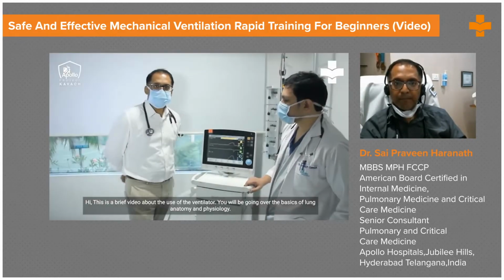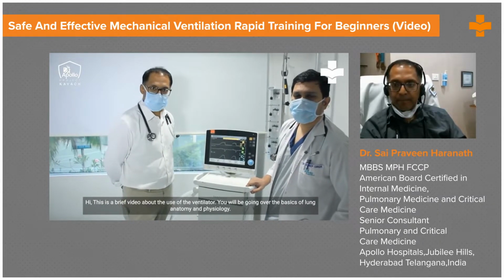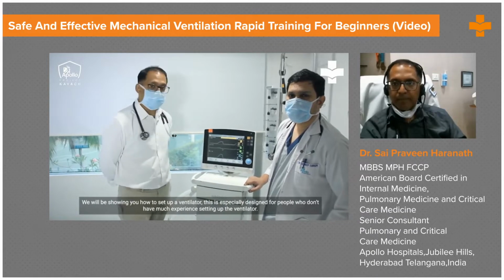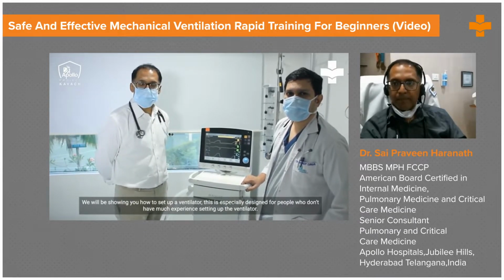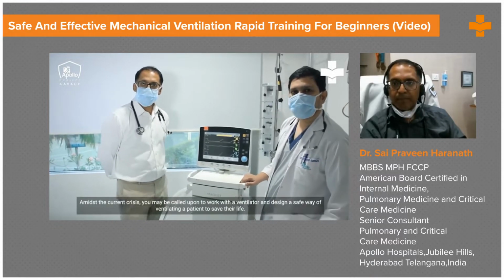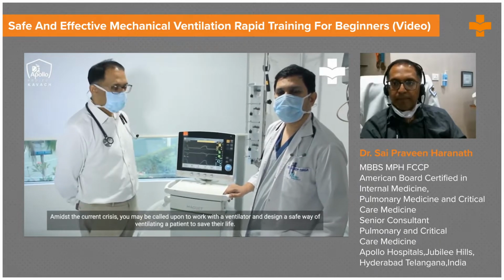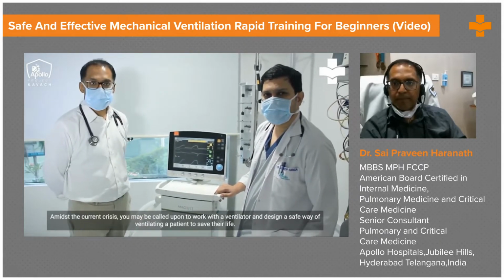Hi, this is a brief video about the use of a ventilator. We will be going over the basics of lung anatomy and physiology. We'll be showing you how to set up a ventilator, and this is designed for people who don't have much experience using ventilators. In the current crisis, it is possible that you may be called upon to work with a ventilator and design a safe way of ventilating a patient to save their life.